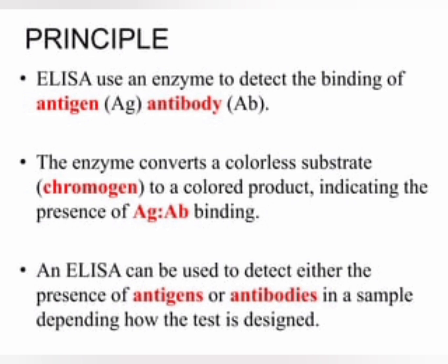In a typical assay of HIV antibodies, recombinant envelope and core proteins of HIV are attached to the solid phase support of microtiter plate wells. Serum antibodies against epitopes on these viral proteins are produced by individuals infected with HIV and can be detected within 6 weeks of infection using the indirect ELISA method.